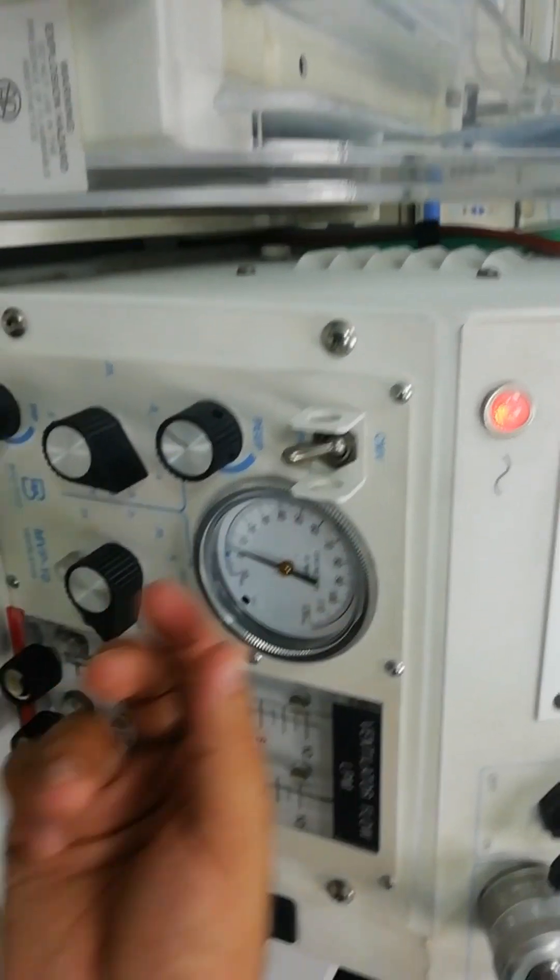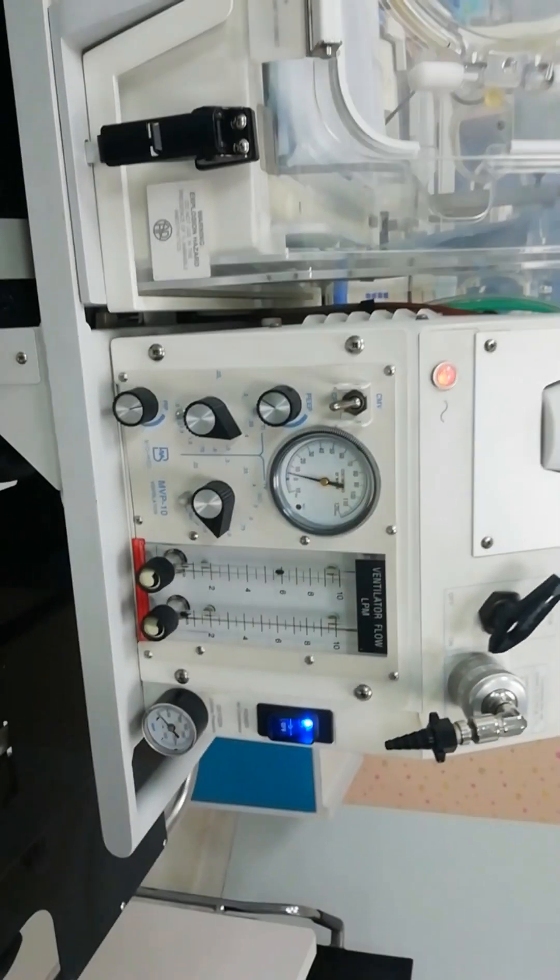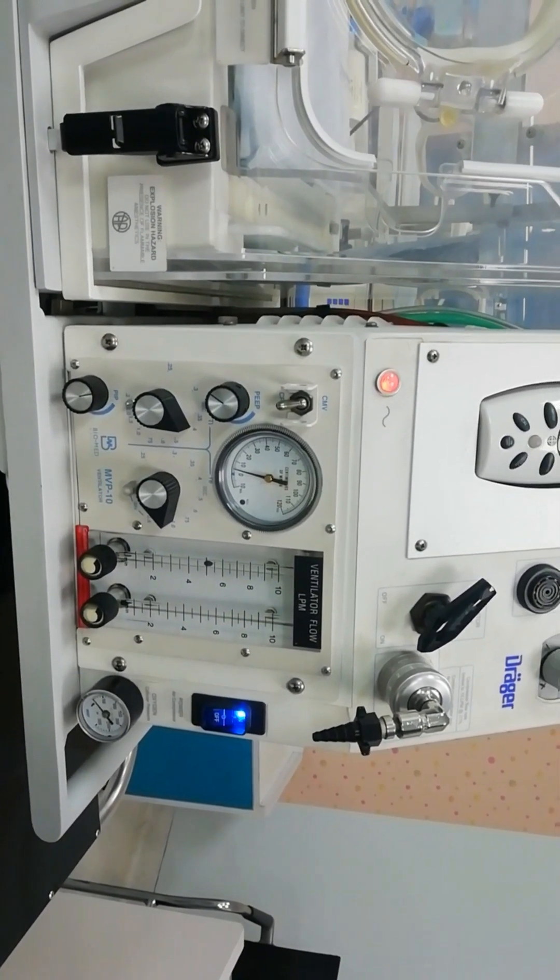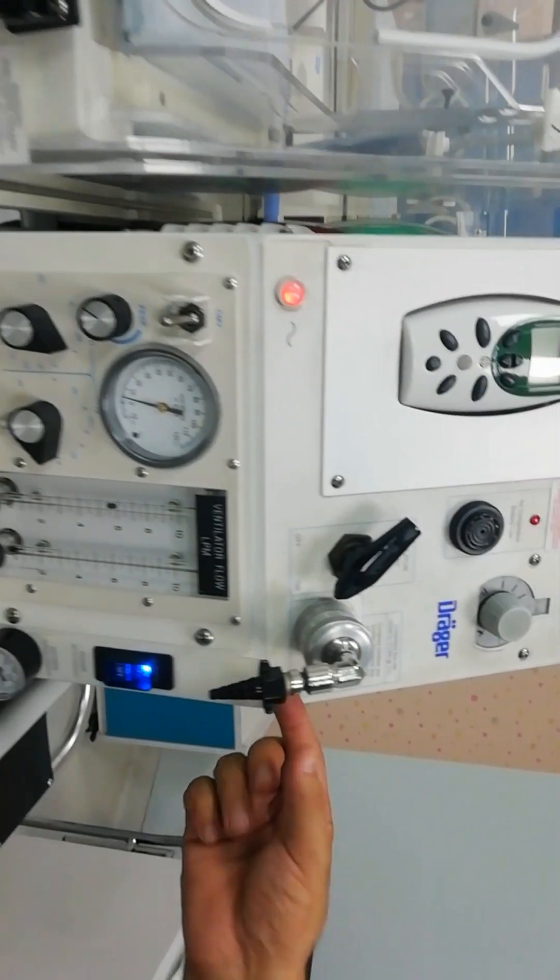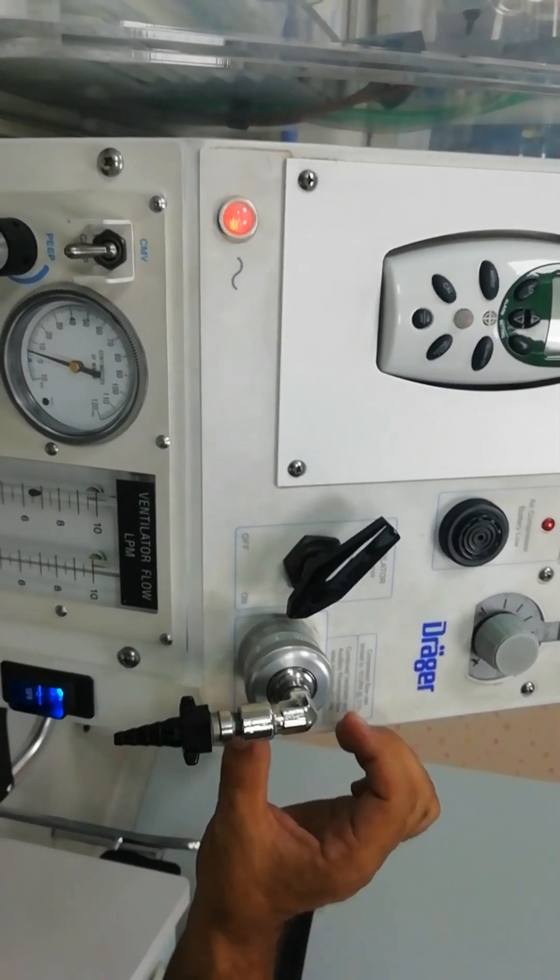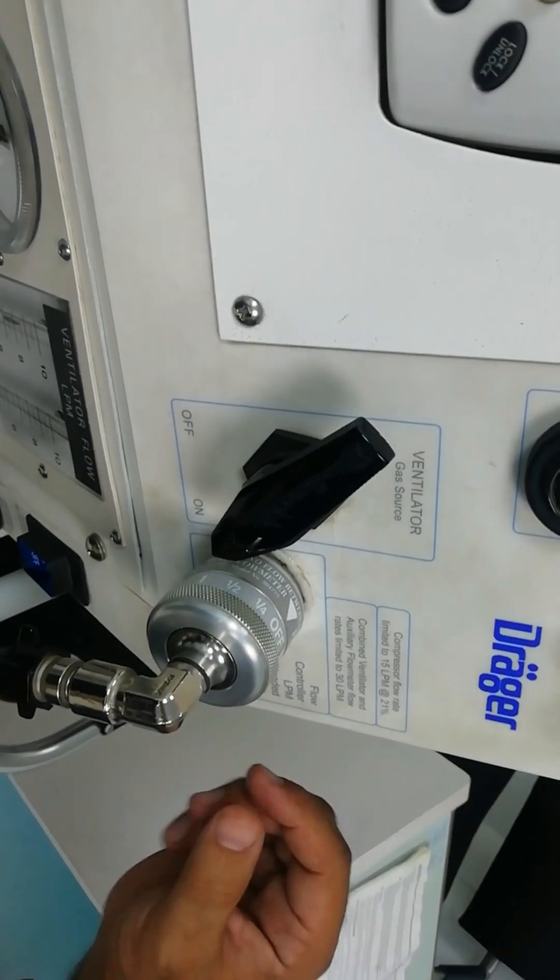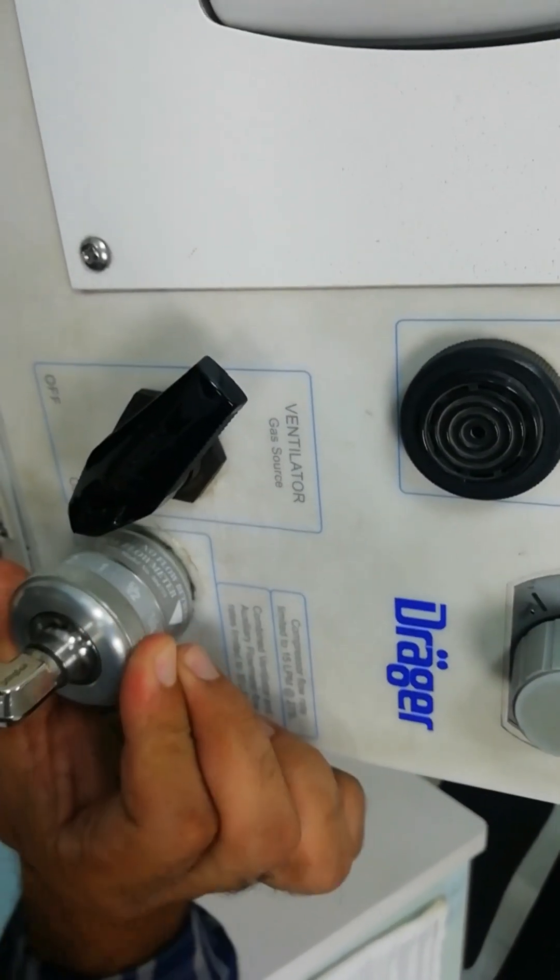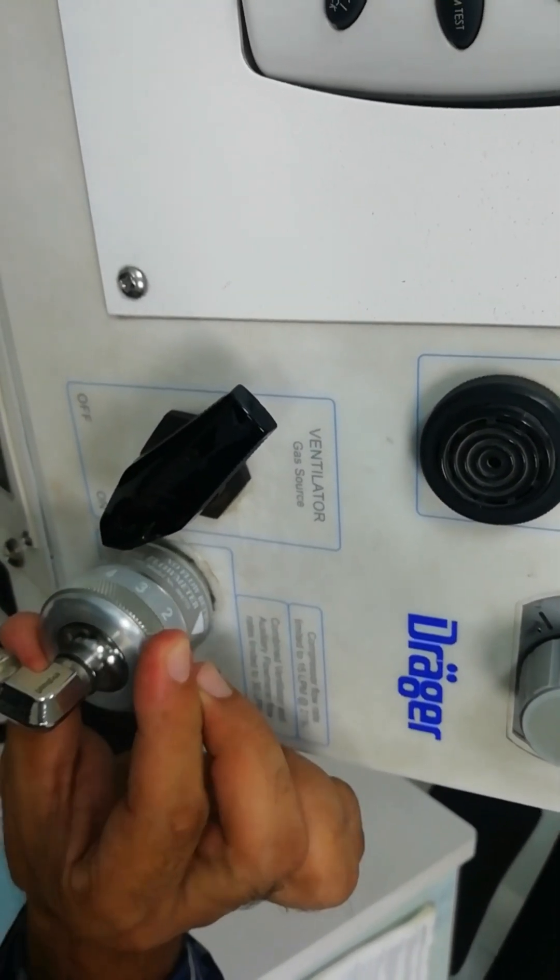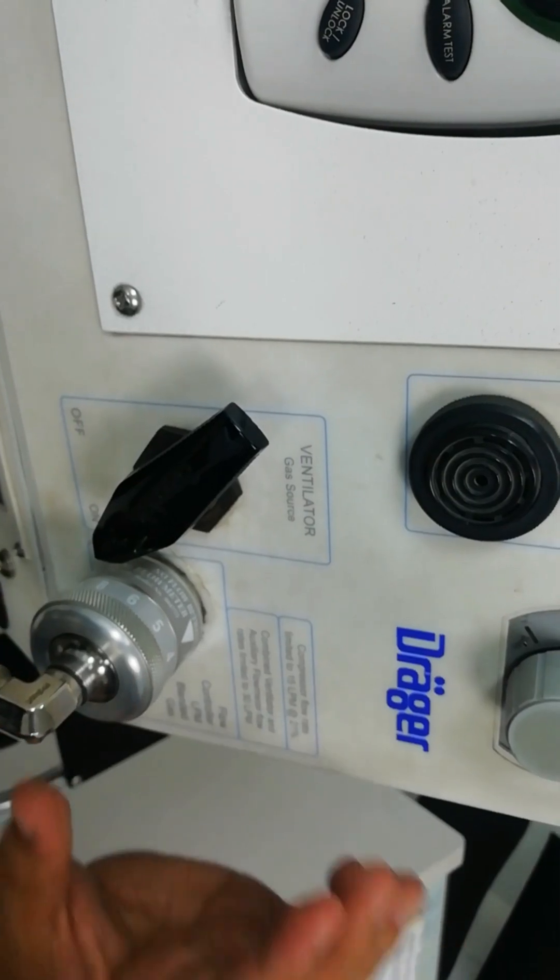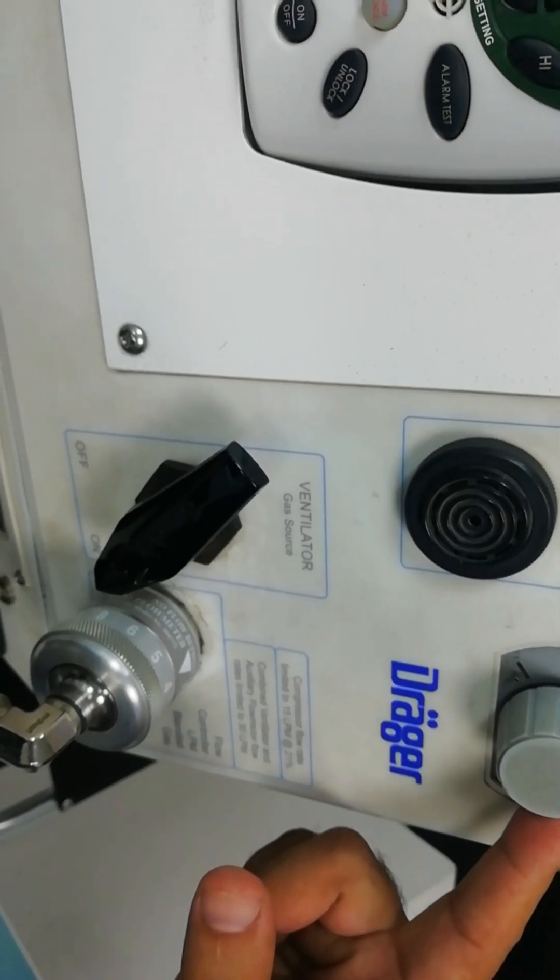So if the patient does not need any support of pressures but just needs oxygen, you can use this port. This port can supply the patient with up to 15 liters per minute of blended oxygen. We can set it at one liter, two liter, three liter according to the desired, and you control the amount of percentage of oxygen you need.